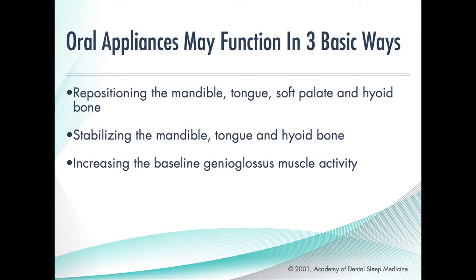So when you increase the tension of the soft palate, there goes your snoring. Almost first day. I always say 2 days, under promise, over deliver kind of thing. I always say 2 days, your snoring will disappear in 2 days. And 99% of the time I'm right. It's usually 1 day though. And they come back, no, it's a 1 day. Gotcha. So we reposition the jaw. We stabilize the mandible and the hyoid. There's a study they did about the stimulation of the genioglossus muscle.